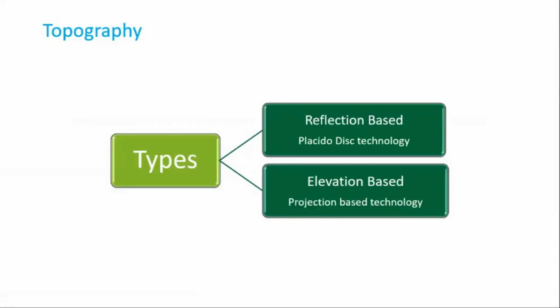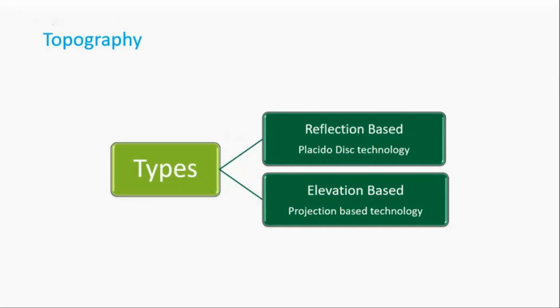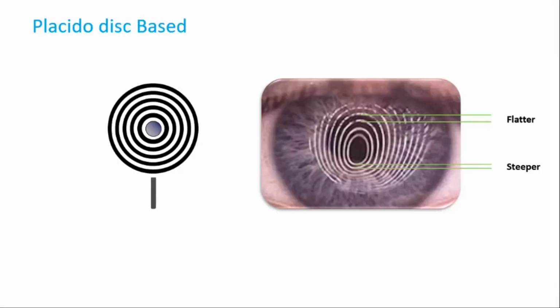So there are two techniques available while doing topography. One is the reflection based, that is Placido disc based technology, and the other is elevation based technology, that is projection based technology.